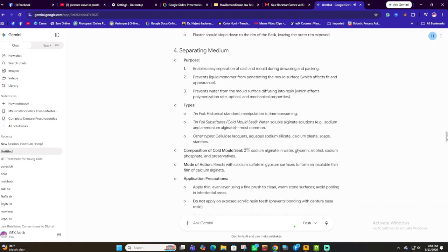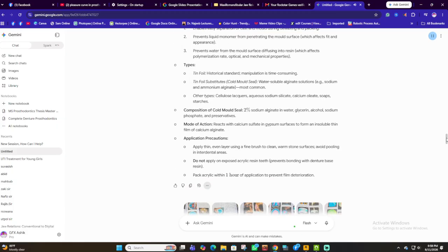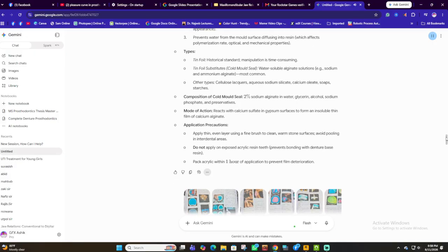Composition of cold mold seal: 2% sodium alginate in water, glycerin, alcohol, sodium phosphate, and preservatives. Mode of action: reacts with calcium sulfate in gypsum surfaces to form an insoluble thin film of calcium alginate.